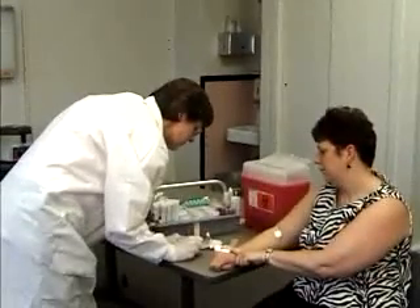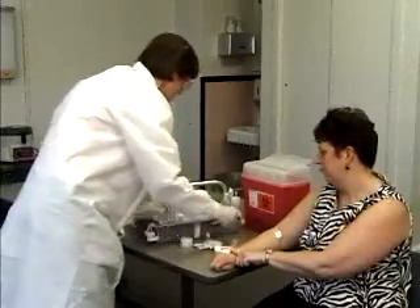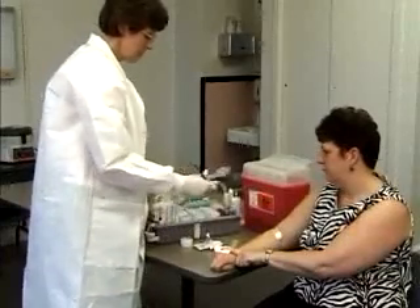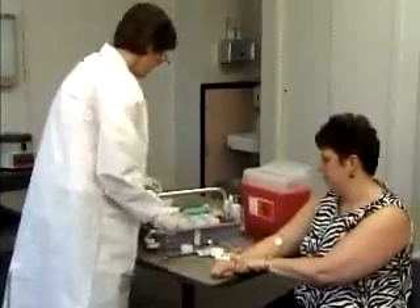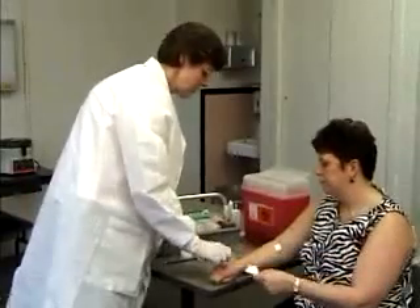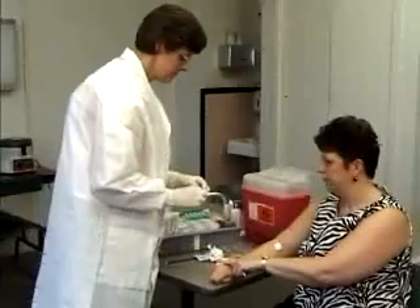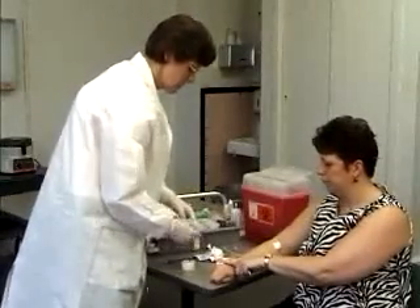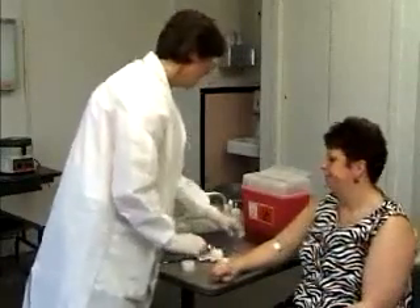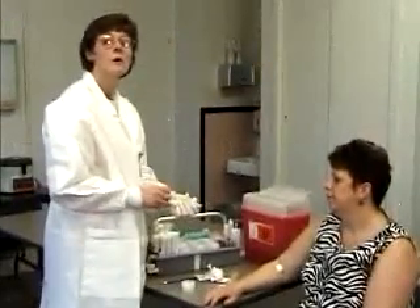Label with patient information — for example, Alice Smith, 75-2463 — then place it in a zip-lock bag to send to the laboratory. Bandage the patient, letting them apply a little pressure, and advise them they can remove the bandage in about 30 minutes. Send the blood to the laboratory, then remove your gloves and wash your hands.